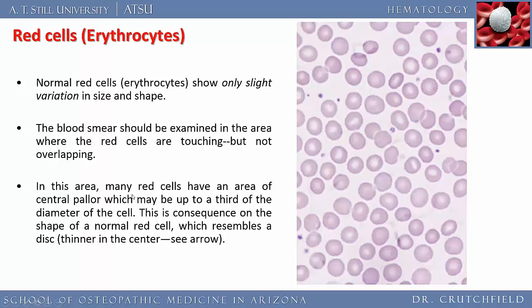And you'll notice that in most of the red cells, this reflective area will take up about a third of the size of the red cell. But if it reflects more than that, you could have hypochromasia, meaning it doesn't stain darkly enough because there's not enough iron within the person's body, and they could have iron deficiency anemia. So there's our picture of our red cell, that little UFO saucer-shaped presentation, and here in the middle of it is a platelet.